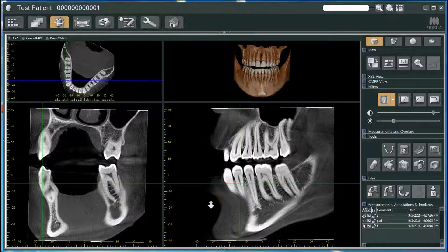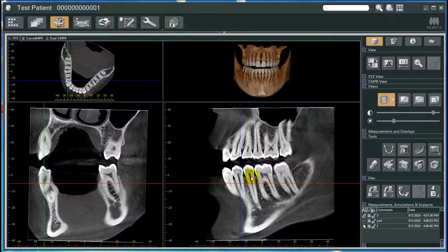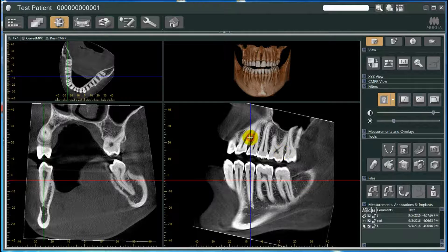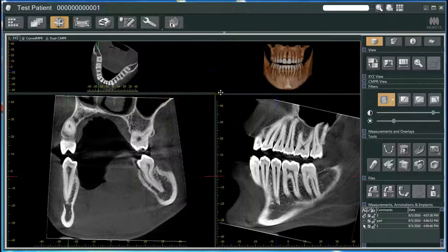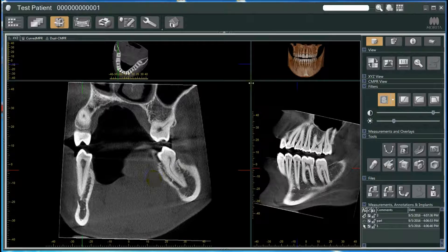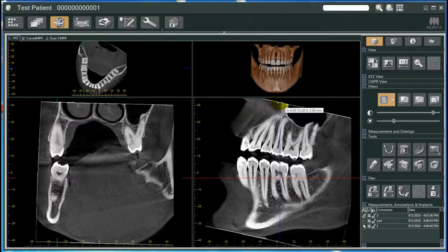For endo, this is what I really like — it's fantastic to view the canals a little better. Say we want to look at number 29 — I can manipulate the blue coronal slice line, and you can see how it's not matching up right with the canal. Rotate the image and you can see that canal perfectly. Turn off the crosshairs and in this view you can see really nicely the entire length of that canal — all because we manipulated the image to line it up perfectly. This is great for lining up molars and premolars, viewing interesting canal anatomy.